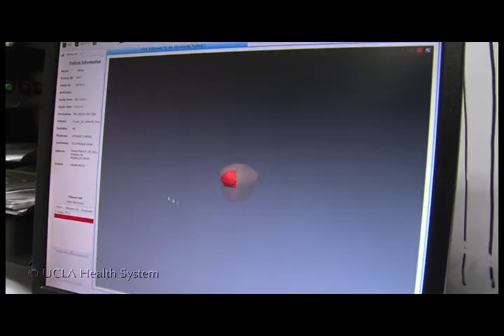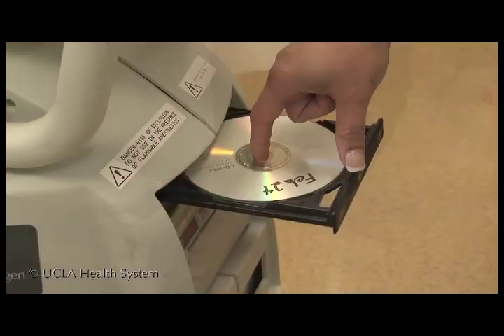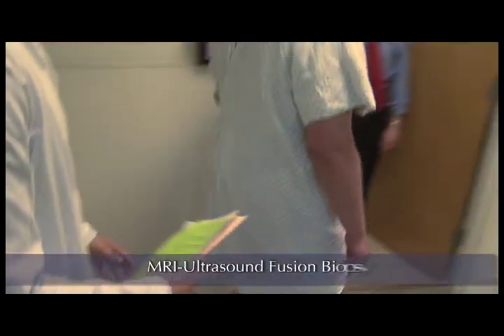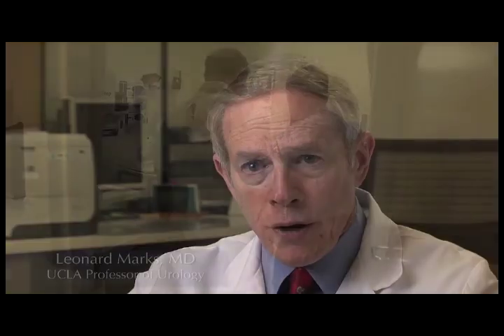When this is complete, I return to the case viewer and notify my clinical colleagues that they can now transfer the data by burning a CD, which is then input into the ARTEMIS fusion biopsy device. The procedure we are performing involves MRI ultrasound fusion to perform targeted prostate biopsy.